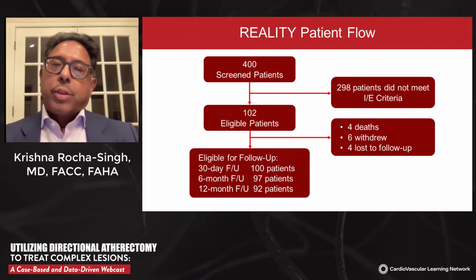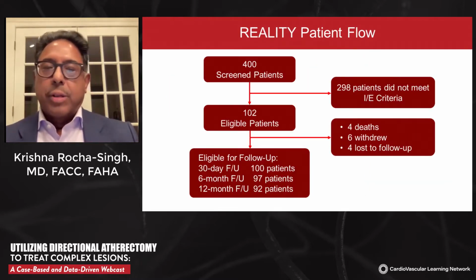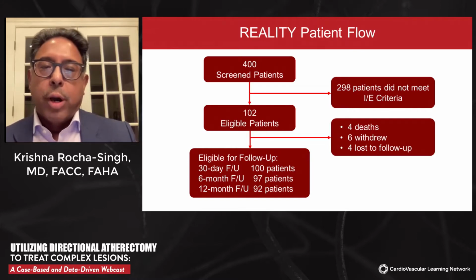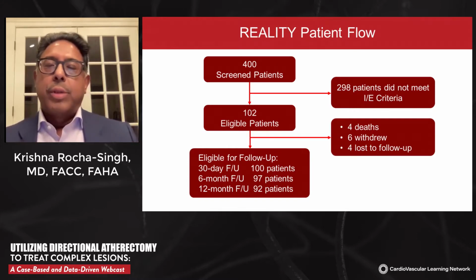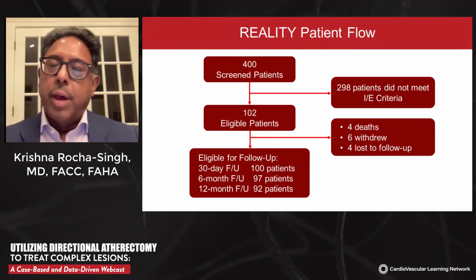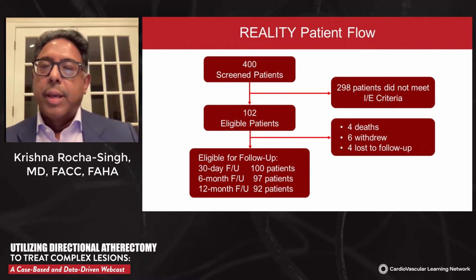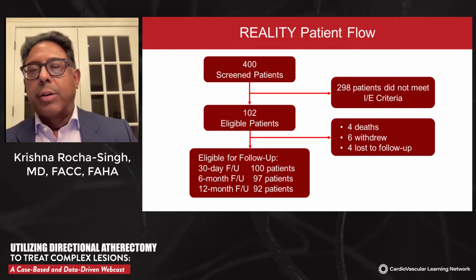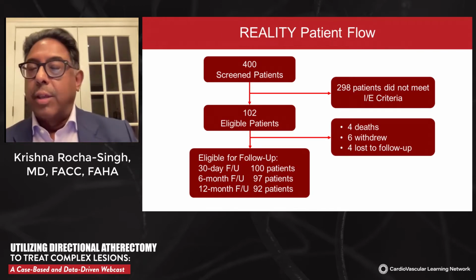I'd like to go over the REALITY patient flow because I do think it reflects exactly the challenges that we met during REALITY. We screened 400 patients, and to your right, we see that almost 300 of them did not meet the entry criteria. I can tell you that the vast majority of them did not meet that criteria because they did not have sufficient either length or calcification.